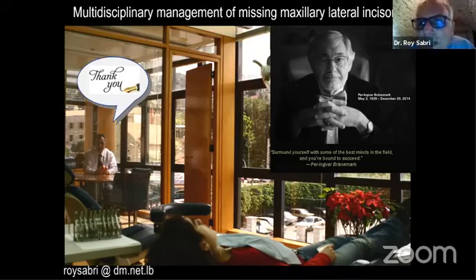Sometimes we extrude a little bit or intrude at the end, depending on the gingival level, so it's better. There is no rush with the reshaping. If the canine is too long, its tip too long, I can remove a little bit, but I don't remove the exact amount, I just remove a little bit.